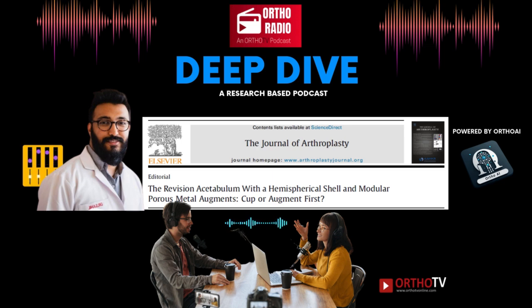So placing an augment after the cup provides extra reinforcement. It's like reinforcing a weak spot in a wall. That's a good way to put it. So the surgeon has to really assess the situation. Definitely, it's a complex decision. They have to consider the bone loss, the quality of the bone, the patient's overall health, and their activity level. It's like a puzzle. Yeah, it really is.